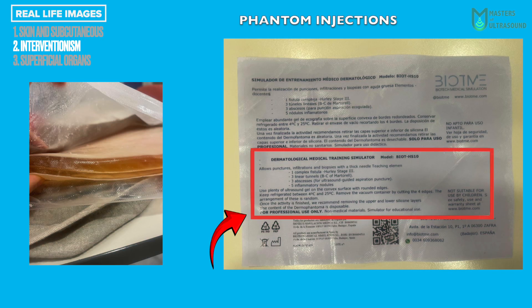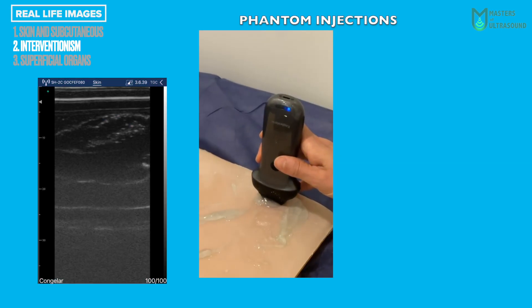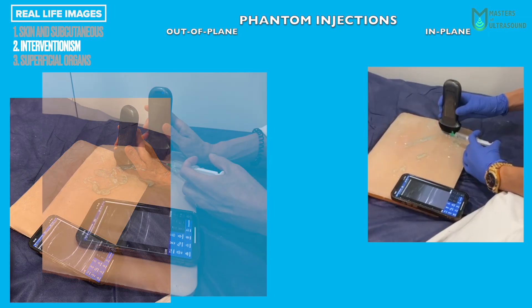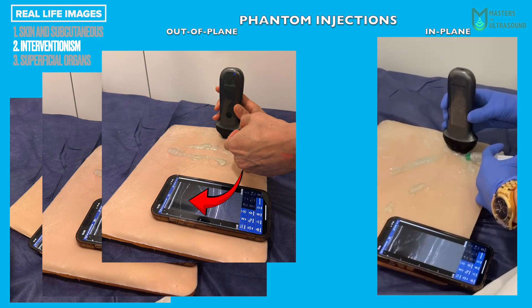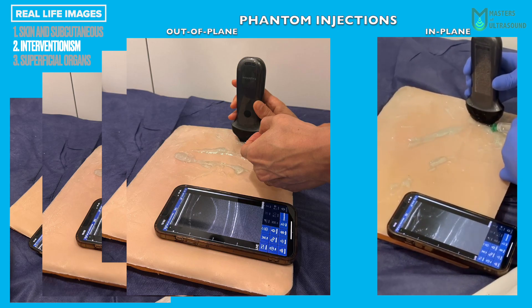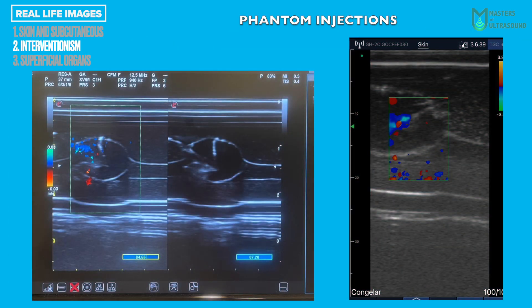Stepping to the second chapter: interventionism. This is the phantom used — note in the red box the contents; we will focus on an abscess localized in the B mode image. Imagine we want to inject a needle into an abscess to drain it or inject corticosteroids into a hidradenitis suppurativa nodule. We have two techniques: out-of-plane, shown in pictures on the left, and in-plane, shown in the video on the right. Note how the needle appears as a point on the left increasing lateral resolution, and as a string on the right increasing depth resolution. Watch the corticoids being injected at the bottom of the nodule. Needle visualization in the Eagle View is not bad compared with an expensive gold-standard machine.